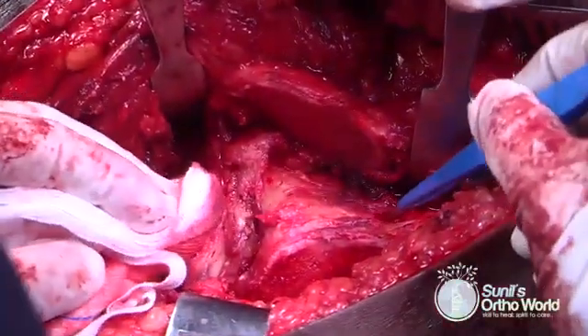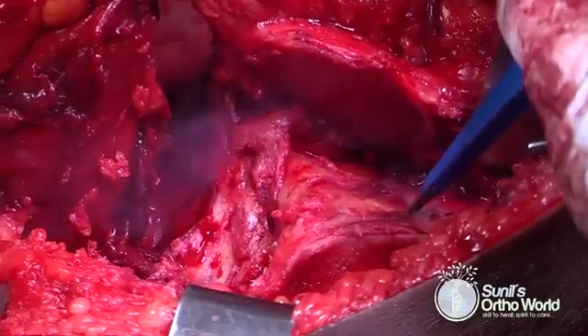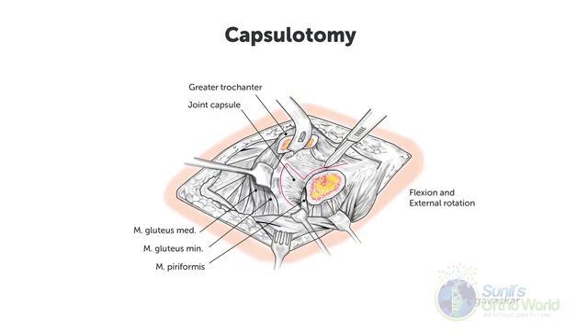Now the entire anterior capsule is exposed and a capsulotomy can be done. The anterior capsulotomy is performed in a Z-shaped fashion as described by Professor Ganz. One however has to remember that atypical capsular tears and avulsions can already be present because of the injury, and you may have to modify your capsulotomy accordingly.